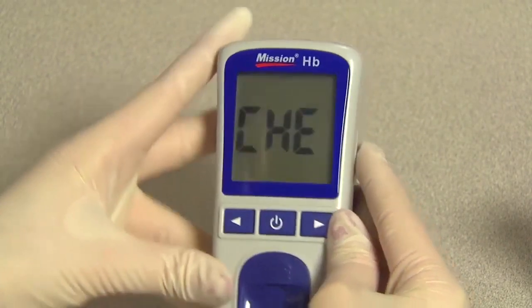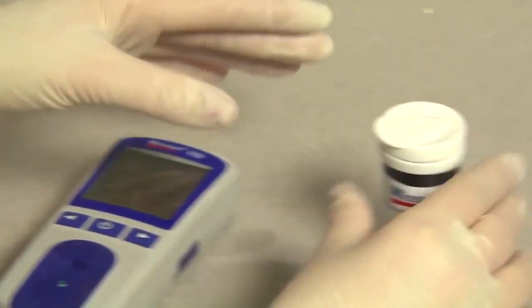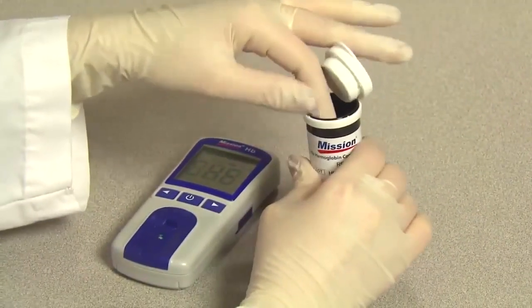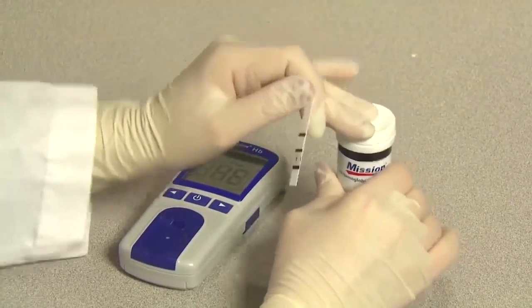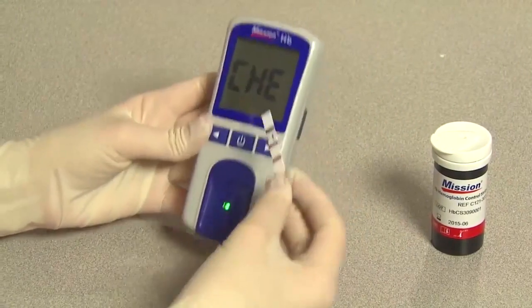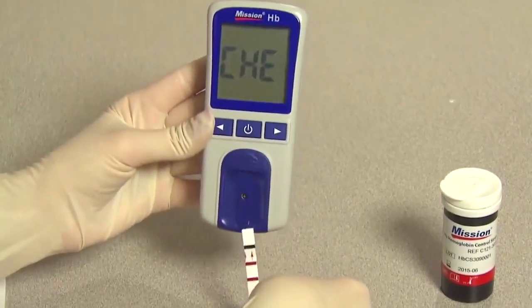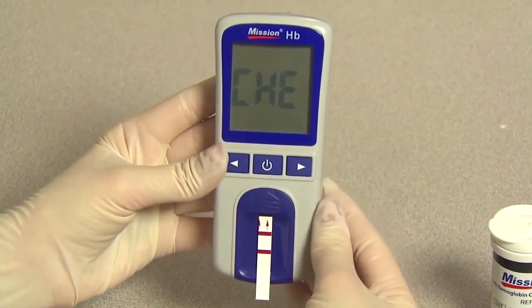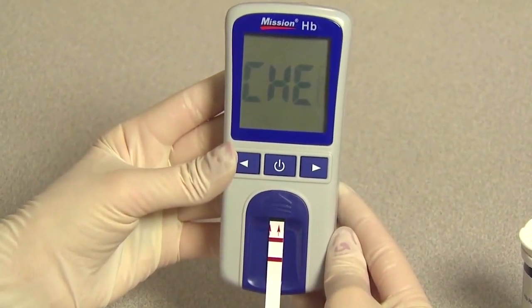Open the canister and remove a control strip. Make sure to recap the canister tightly. Firmly insert the control strip into the strip channel in the same direction as the arrows indicate. Ensure that the control strip is inserted all the way to the end of the strip channel.